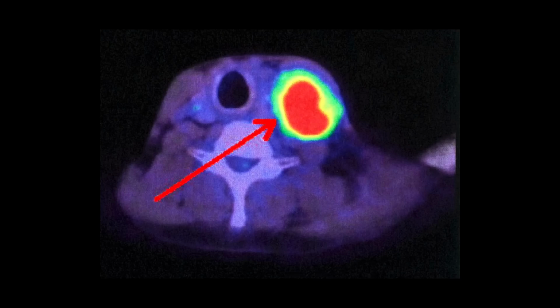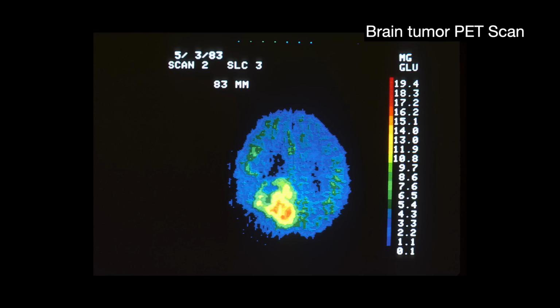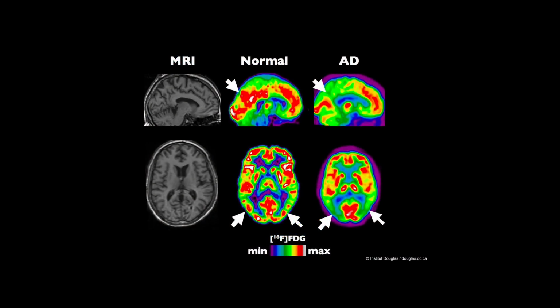For instance, there is a version of a PET scan in oncology that takes advantage of a tumor's rapid uptake of glucose to measure a tumor's growth. PET scans can also help reveal the progression of certain brain pathologies like Alzheimer's. When it is operating normally, a healthy brain uses a lot of glucose. So when it doesn't pick up that glucose as fast as it used to, that can be an indication that something is wrong. The whole scan does not work without the detectors for these high-energy photons.